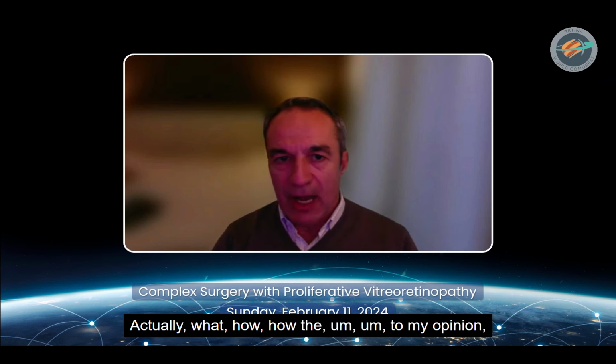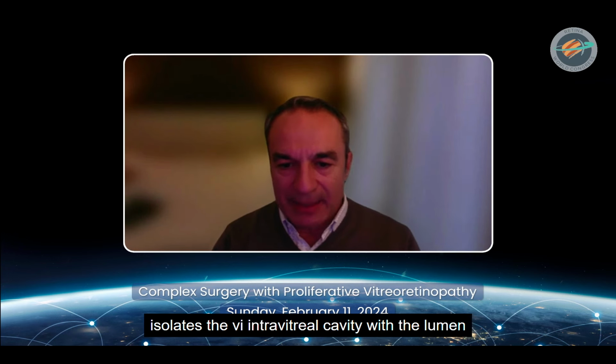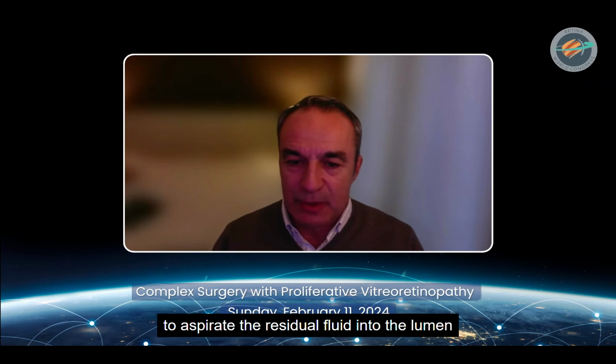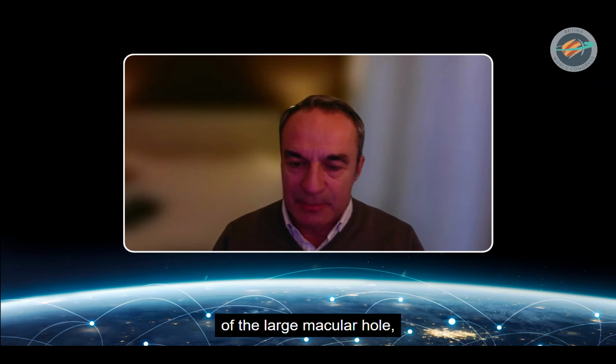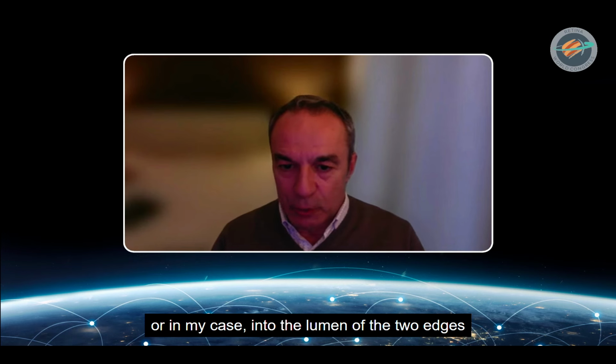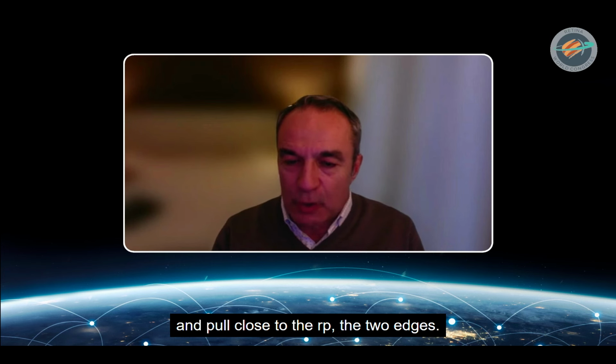Right. Yeah, correct. Actually, yes, that is how, in my opinion, the flap works. The flap actually isolates the intravitreal cavity from the lumen of the break, creates a barrier, and then allows the RPE pump to start to aspirate the residual fluid into the lumen of the large macular hole, or in my case, into the lumen of the two edges of the tear, and try to pull the two edges close to the RPE.